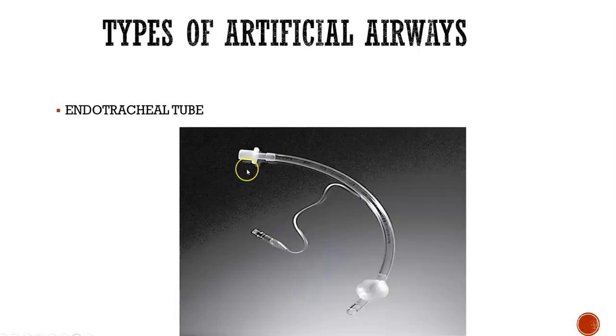Okay, so this is what your normal ET tube looks like. It's inflated at the bottom, so it's got a cuff or a balloon, bulb, whatever you want to call it. And this is the little port that we put air into. Honestly, you as the nurse should never really be the one to put air in this, because you can blow these very easily if you're not careful and you don't have a way to measure the cuff pressure. So basically, respiratory is the one who handles this.